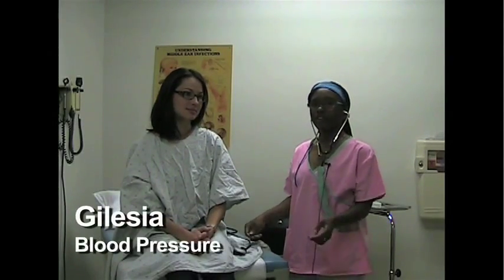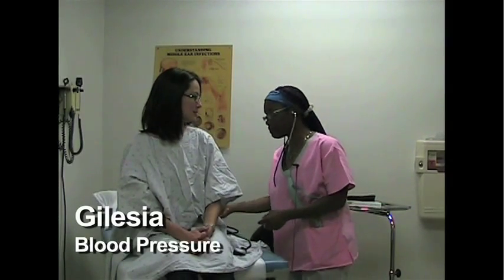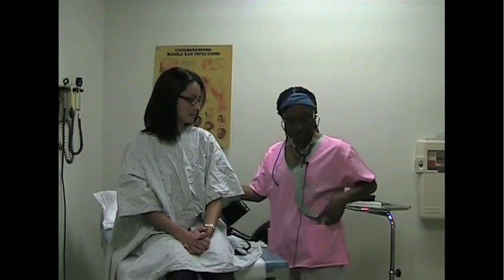Hello, my name is Jaleesa and I'm going to talk to you about measuring blood pressure. To measure blood pressure you use a sphygmomanometer, also known as a blood pressure cuff. And to hear the blood you use a stethoscope so you can hear the blood going against the artery walls.